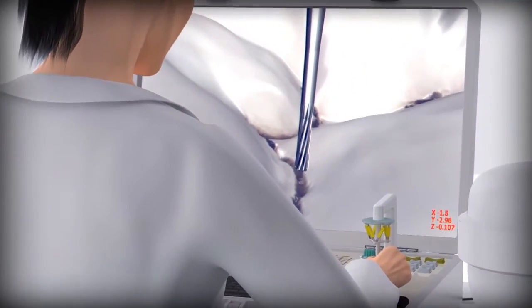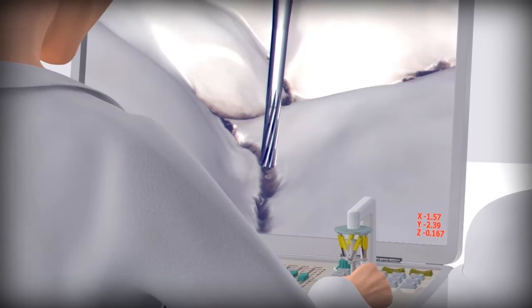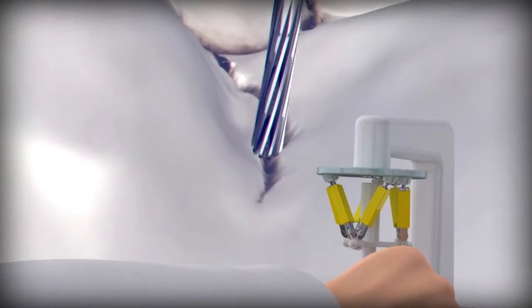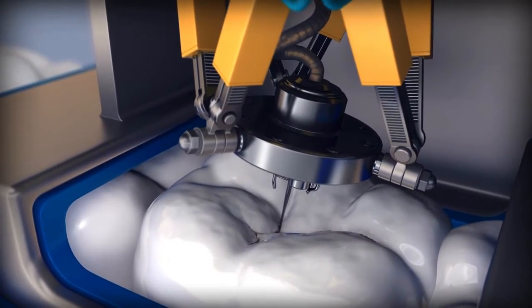The technician marks the affected areas of the tooth, setting coordinates for the points along which the software will build the drill's future route. The more key points the technician marks, the more precise the route will be.